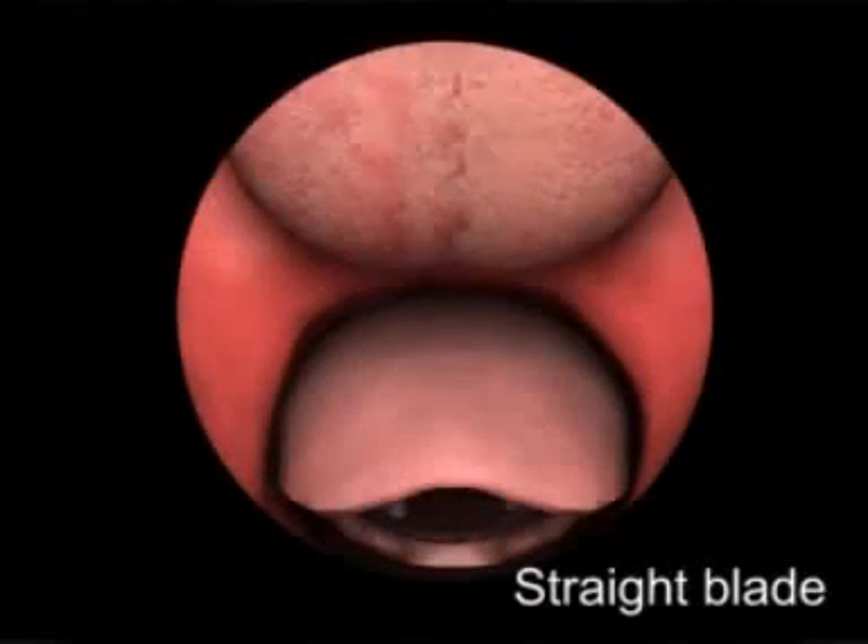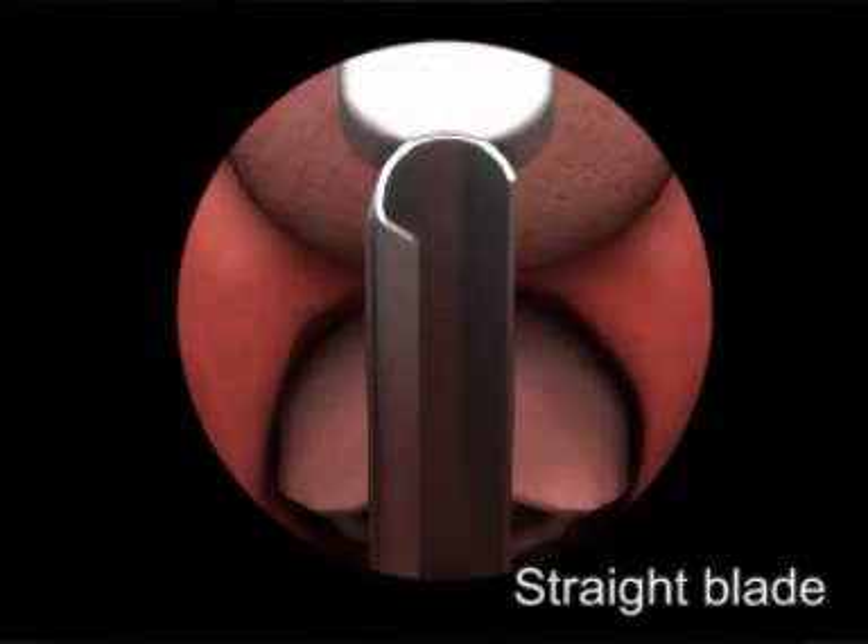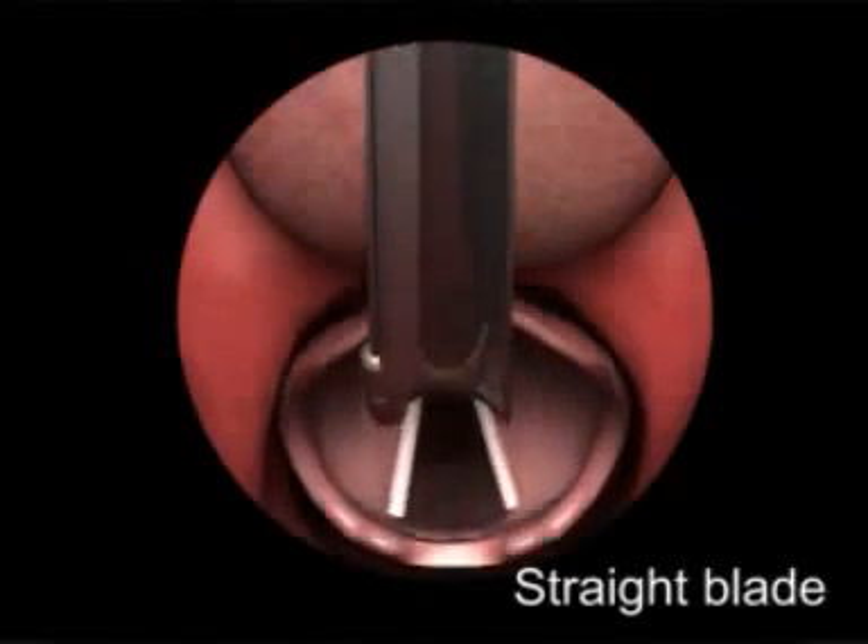When using a straight blade, place the tip of the blade just past the epiglottis and lift anteriorly to expose the vocal cords.